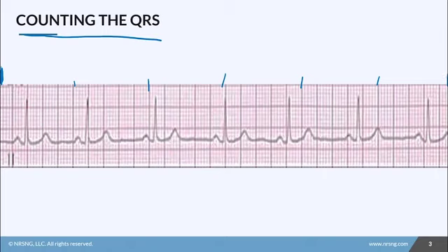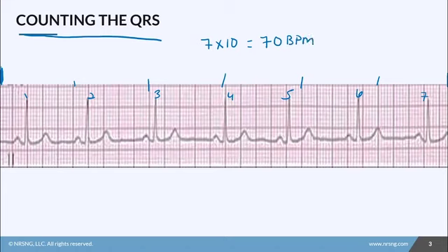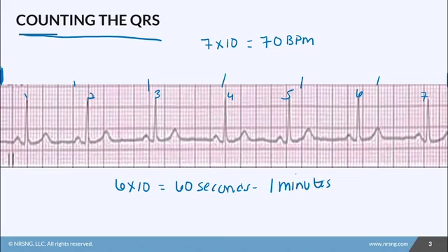From here to here it is six seconds, so I have a six-second strip. I then count my QRS: 1, 2, 3, 4, 5, 6, 7. I multiply 7 times 10 and I get a heart rate of 70 beats per minute. The reason you multiply by 10 is because 6 times 10 equals 60 seconds, which is one minute — so that's why you multiply by 10 to get your heart rate per minute.